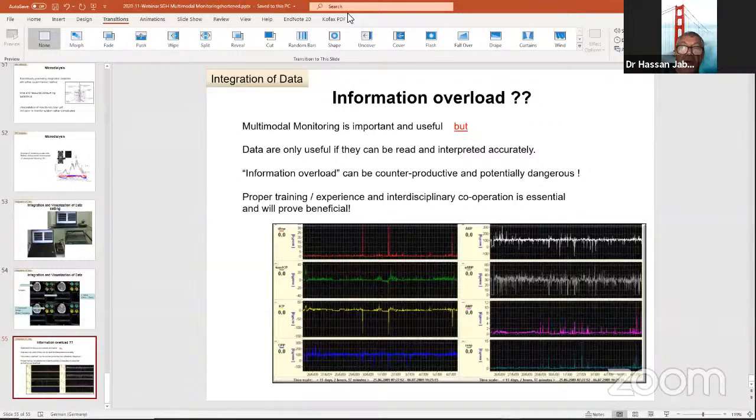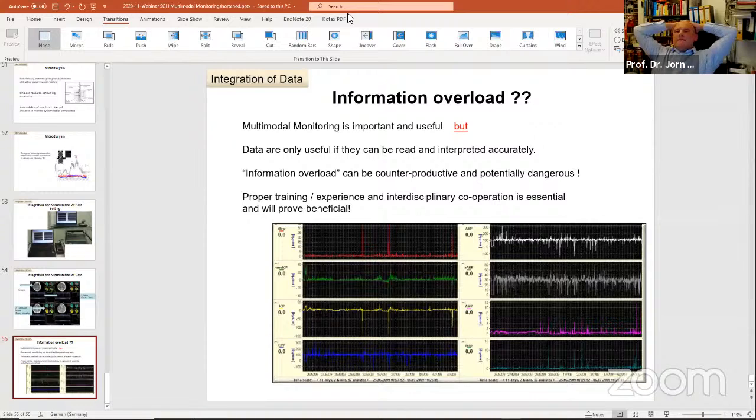With the oxygen probe, it's very regional. If you have it in the ischemic area, then you have a very low reading. If you have it in the non-ischemic area, you have a high reading. So if you do it in an infarction or a compressed area or ischemic area, you'll have different readings, and you might, for example, draw conclusions which are not really necessary. Like, you say, for example, I have to do decompression, but it's a small infarcted area. So this is, I think, a problem as well, no?